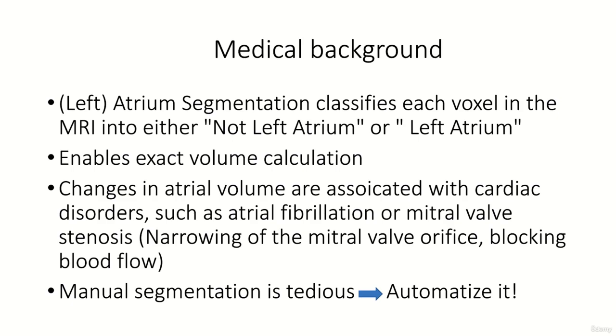However, as you might already imagine, manual segmentation is an extremely tedious task, because the radiologist has to manually segment the left atrium in all slices where it is visible. Therefore, let's automate it. Alright, let's talk data.